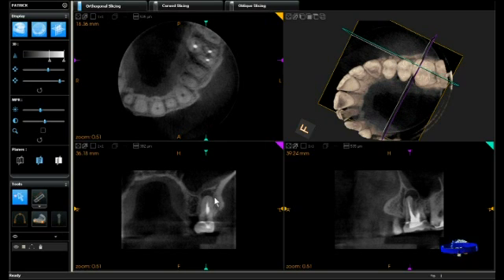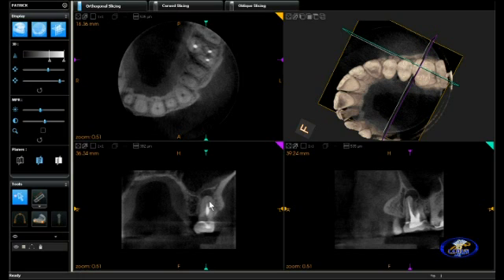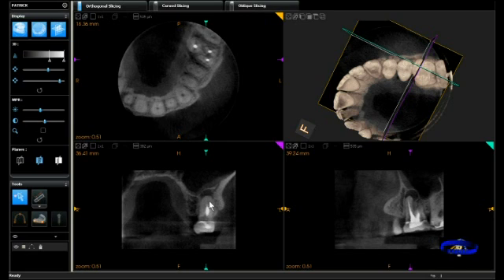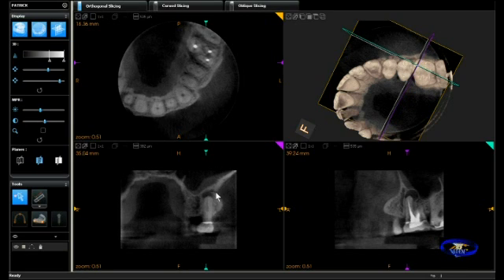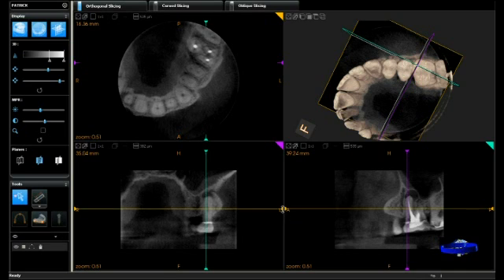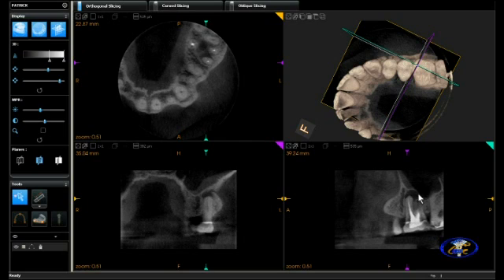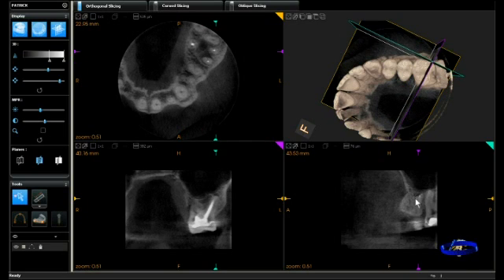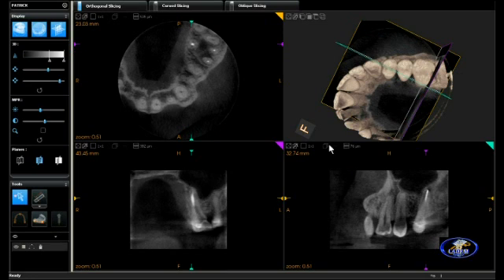In the lower left coronal view we can clearly see a fistula draining from the apical area into the sinus. Scrolling carefully through the coronal view, we can also see a fistula through the cortical plate of the buccal. Scrolling through the axial slices allows us to visualize the root canal morphology. Clicking with the mouse wheel on each root in the axial view allows us to visualize each root individually, unencumbered by superimpositions.